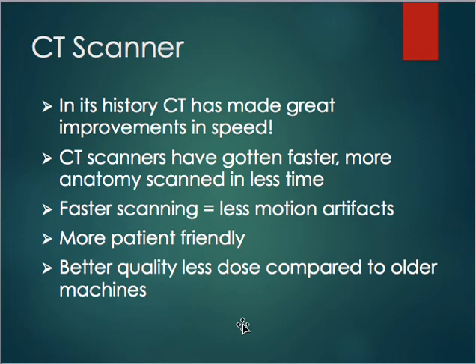So just for price reference, a 64 slice scanner costs about $1 million. And a 320 slice scanner is about $2.5 million. So they're pretty expensive when you think about it like that.